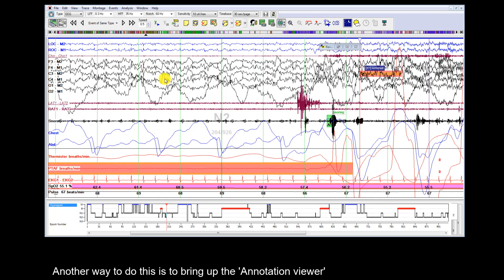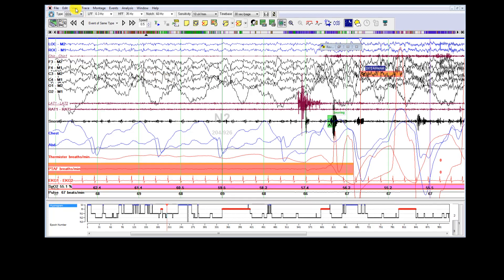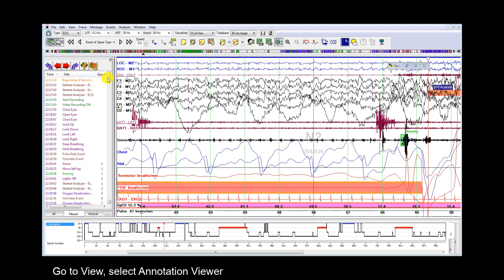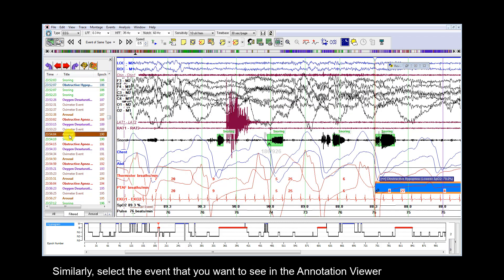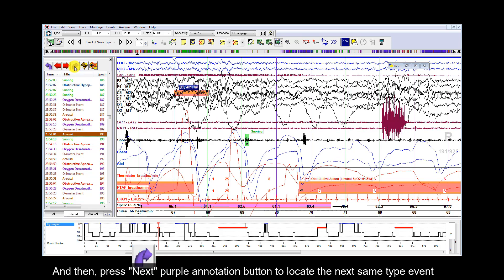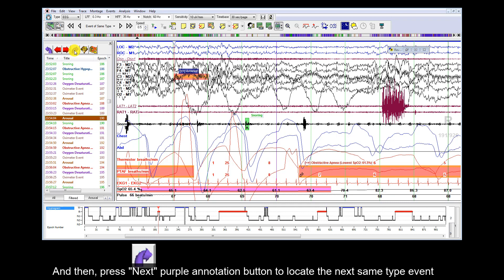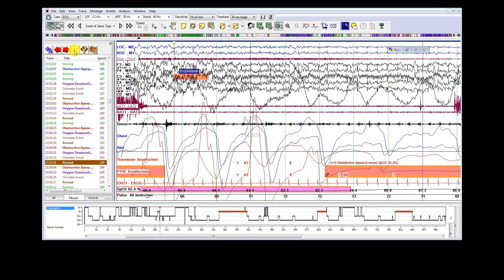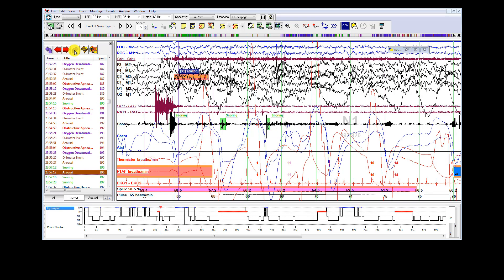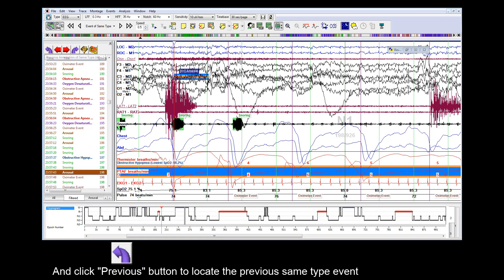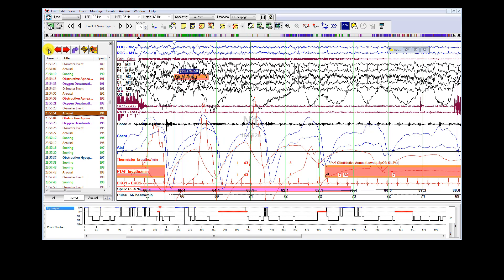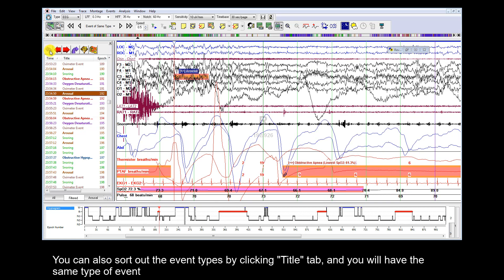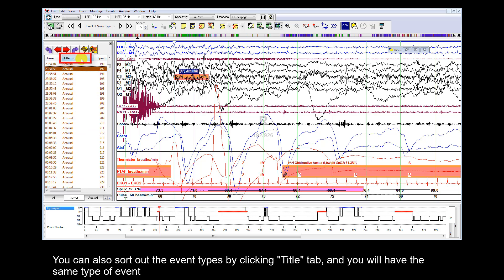Another way to do this is to bring up the Annotation Viewer. Go to View and select Annotation Viewer. Select the event that you want to see in the Annotation Viewer, then press the Next Annotation button to locate the next same type event, and click the Previous button to locate the previous same type event. You can also sort event types by clicking the Title tab to group the same type of events.